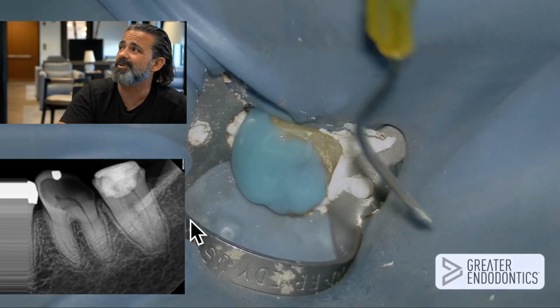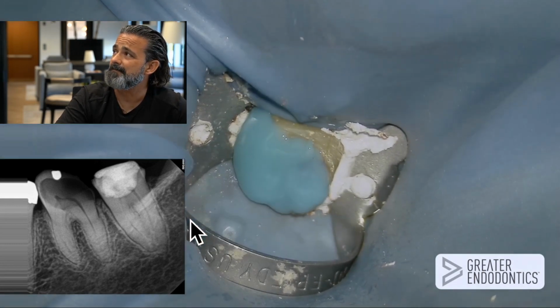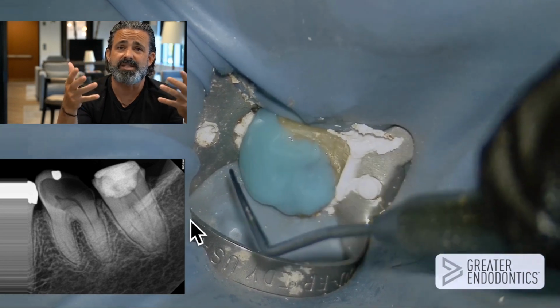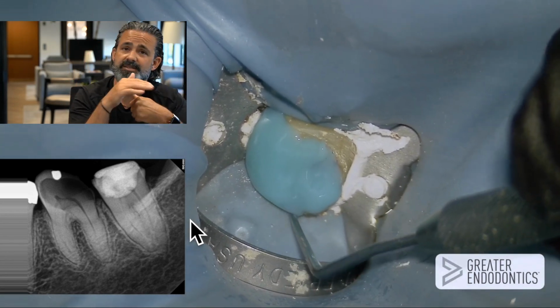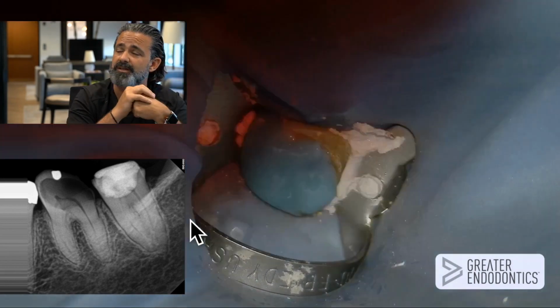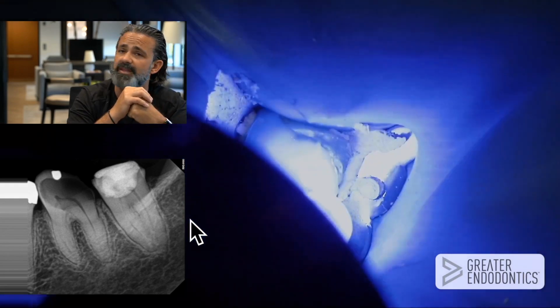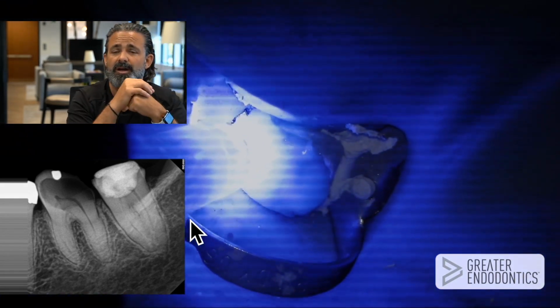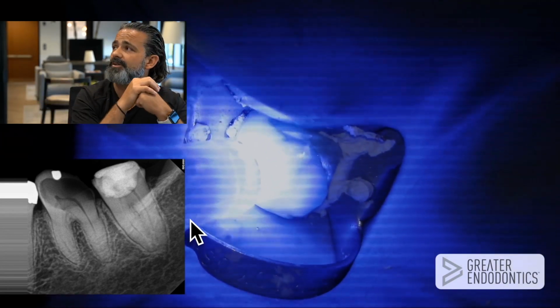So I'm not really trying to make a tooth, but I can make the box form of the tooth, guessing where those walls are, just so visually, when I re-access, it makes sense to my mind. And I'm just making sure that it's pushed up, closing the contact, so to speak, on that distal. I didn't want that rubber dam flipping over it, so I drug my explorer along that, dragging the dam to close the gap there, so there wouldn't be any gaps.